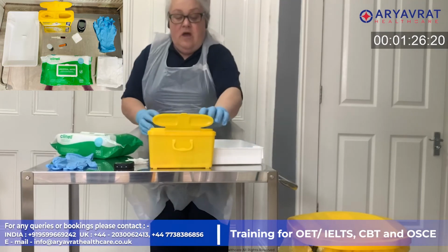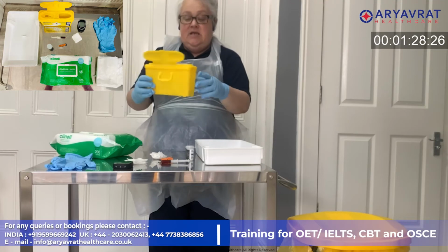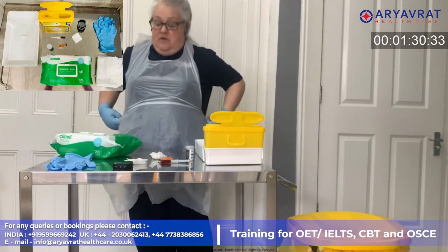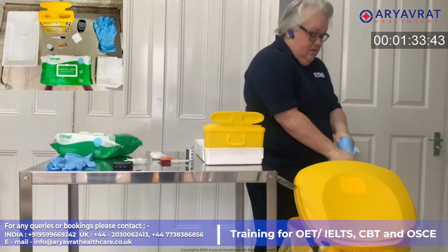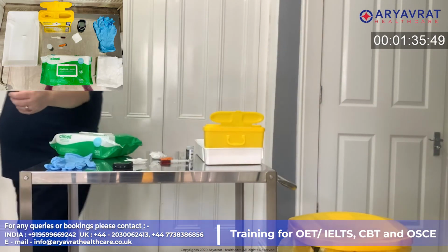Okay, so I am going to take a sharps box, making sure that it's all completed and not over full in there. Okay, I'm going to dispose of these gloves and apron. And with my hand hygiene.